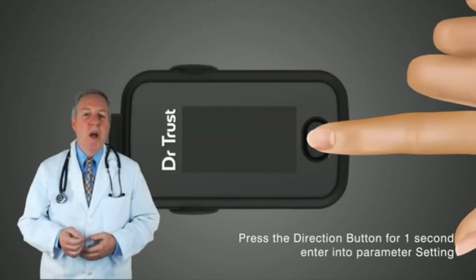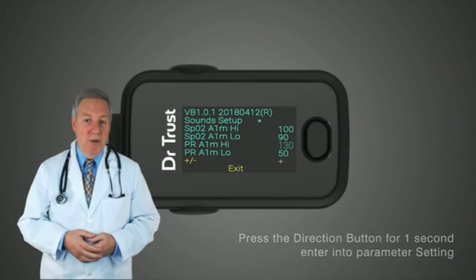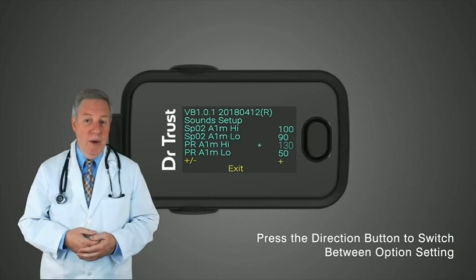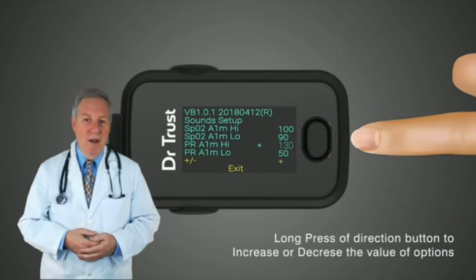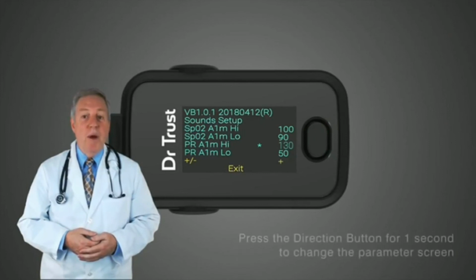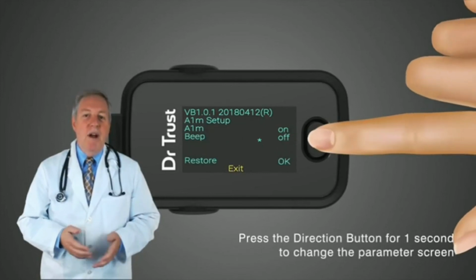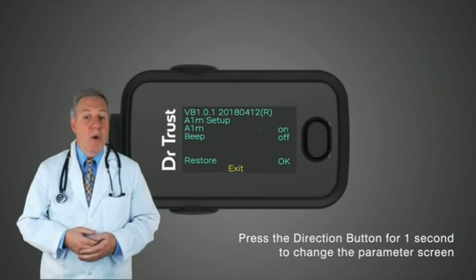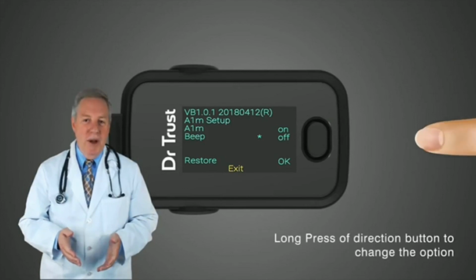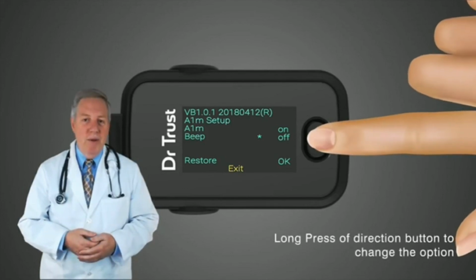It includes a visual alarm function for real-time spot checks. The default upper limit for hemoglobin saturation is 100, and the bottom limit is 90. The default upper limit for pulse rate is 130, and the lower limit is 50. The alarm function can be turned on or off, and the high-low limits of alarm function for hemoglobin saturation and pulse rate can also be changed as per the patient's requirements.